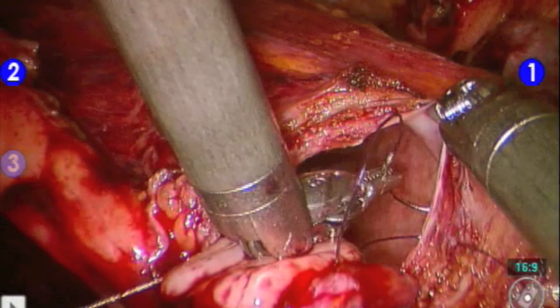At an appropriate point in the anastomosis, we place our ureteral stent.